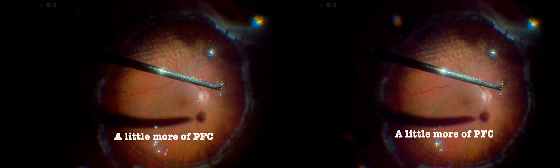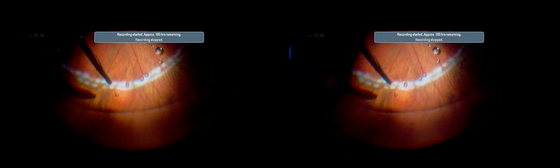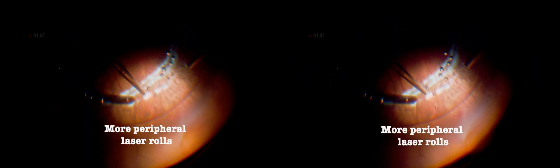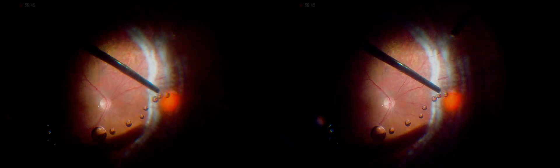A bit more perfluorocarbon liquid is injected to provide thorough coverage from the center to the far periphery. New laser spots are then applied anterior to the first line of laser to complete the attachment. Tiny air bubbles may form during laser coagulation, as the laser can vaporize small amounts of fluid — these bubbles are harmless and can be removed with additional vitrectomy afterward.